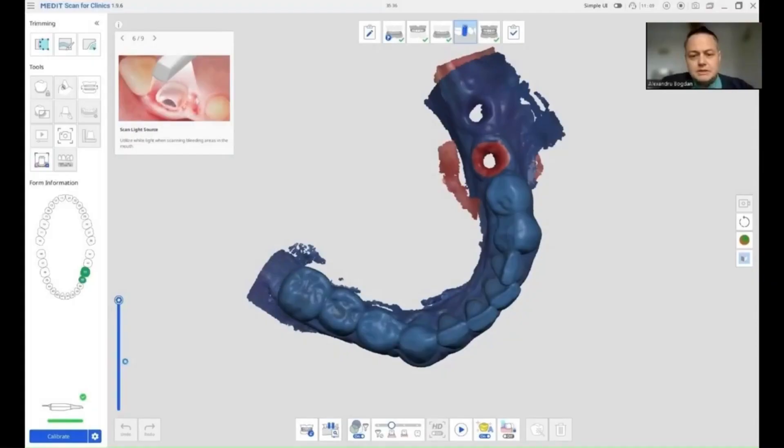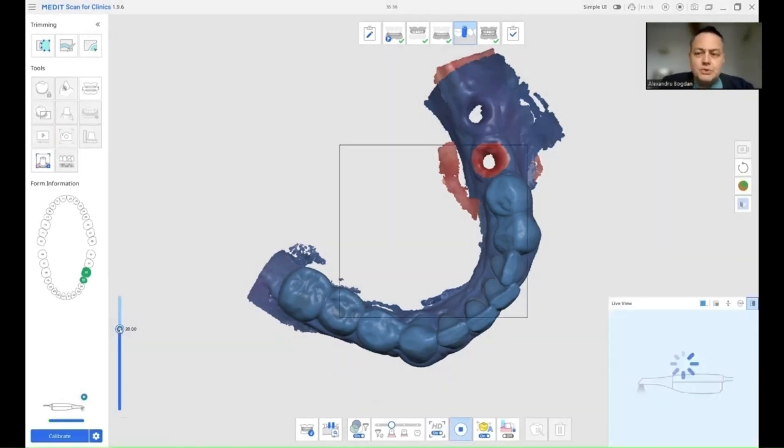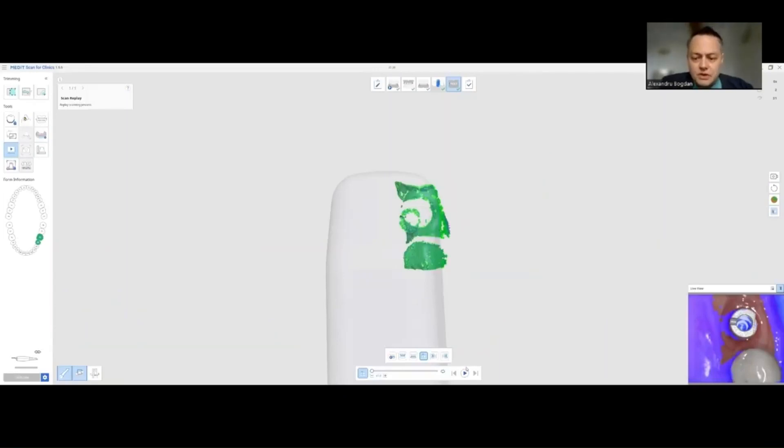Let's start by screwing in our scan bodies. And after we have our scan bodies in place, we'll do things as follows.